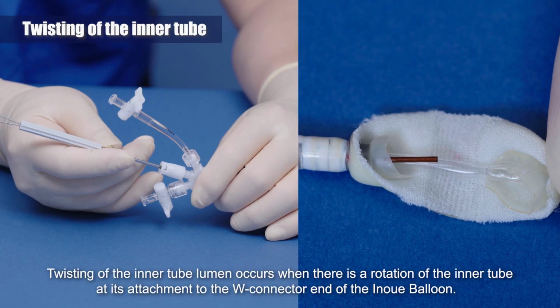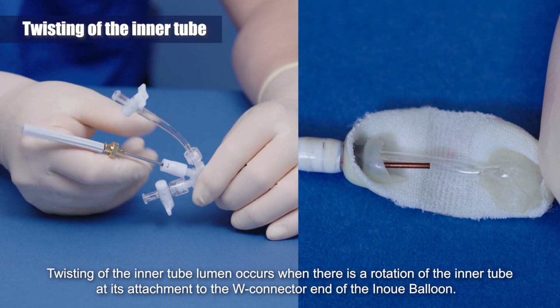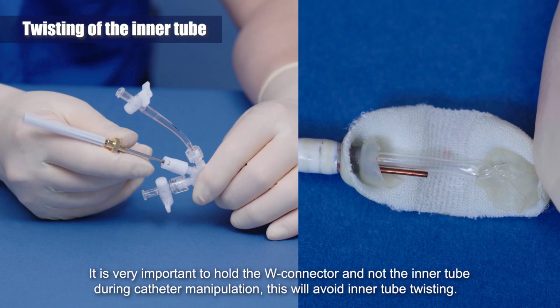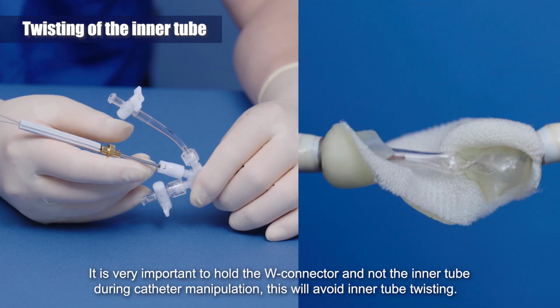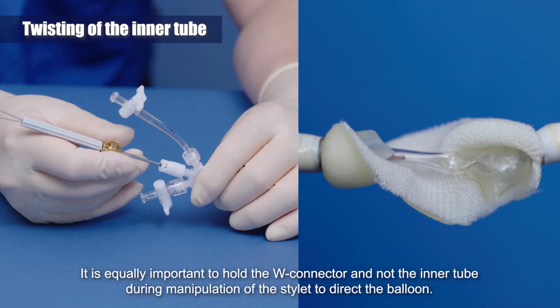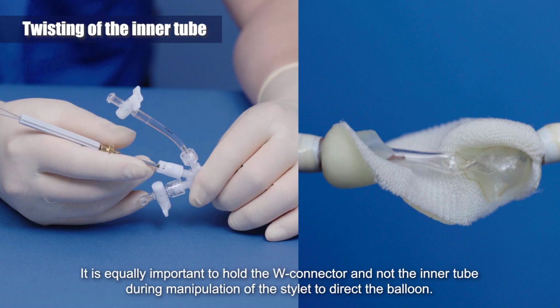Twisting of the inner tube lumen occurs when there is a rotation of the inner tube at its attachment to the W connector end of the Inoue balloon. It is very important to hold the W connector and not the inner tube during catheter manipulation. This will avoid inner tube twisting. It is equally important to hold the W connector and not the inner tube during manipulation of the stylet to direct the balloon.